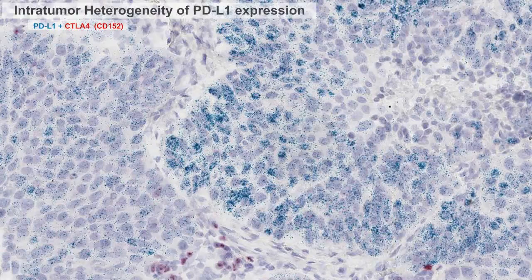And here is an image of a non-small cell lung carcinoma sample, which will be the focus of the study presented to you momentarily. Evident in the above image and throughout the study, we observed a great deal of intratumor heterogeneity of all markers in almost all tumor samples.